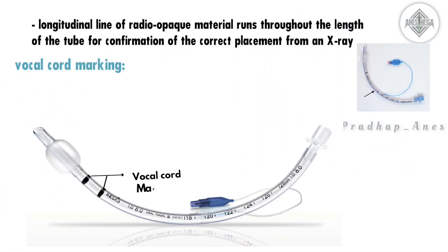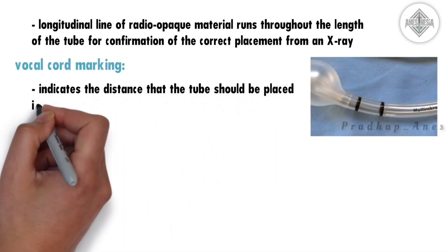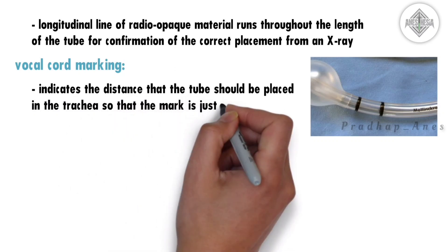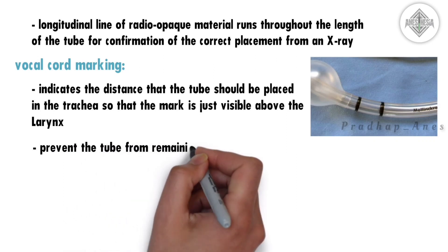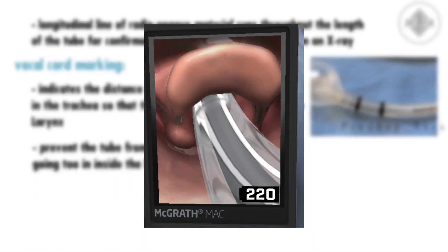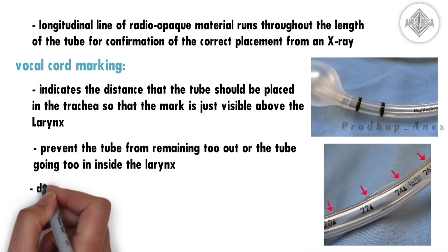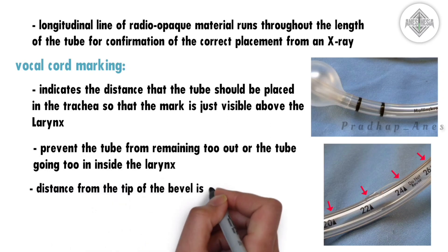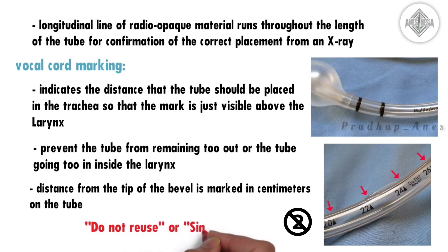Then we can see some bold transverse black lines made a few centimeters above the cuff. This is called vocal cord marking. It indicates the distance the tube should be placed in the trachea so that the mark is just visible above the larynx, preventing the tube from being too shallow or too deep. The distance from the tip of the bevel is also marked in centimeters on the tube, so we can roughly place the tube in its correct position. There will also be cautionary notes such as 'do not reuse' or 'single use only' if the tube is disposable.